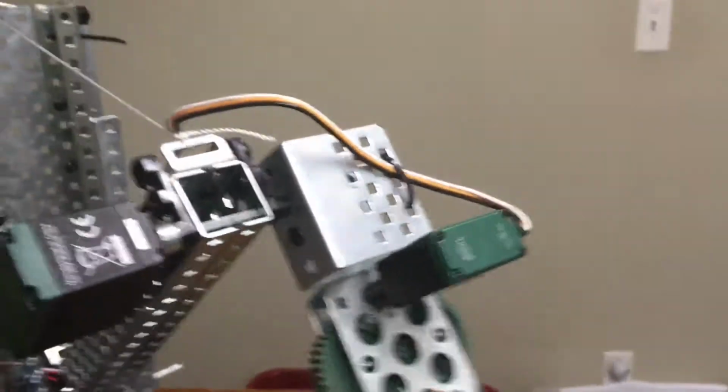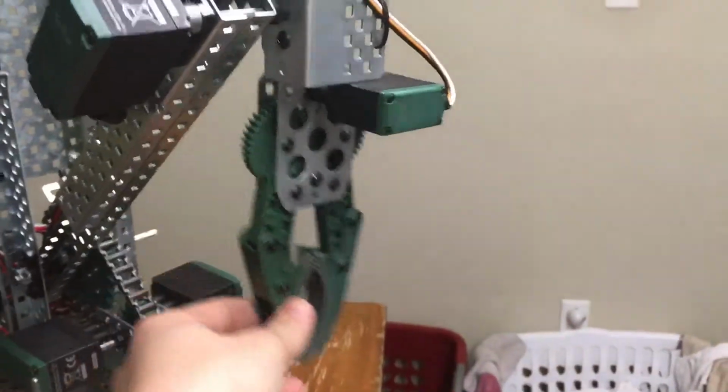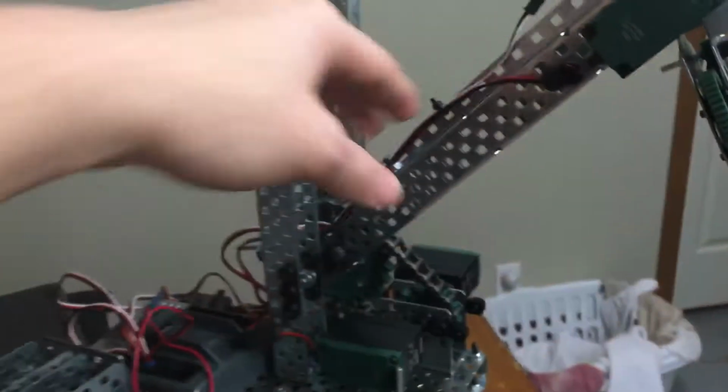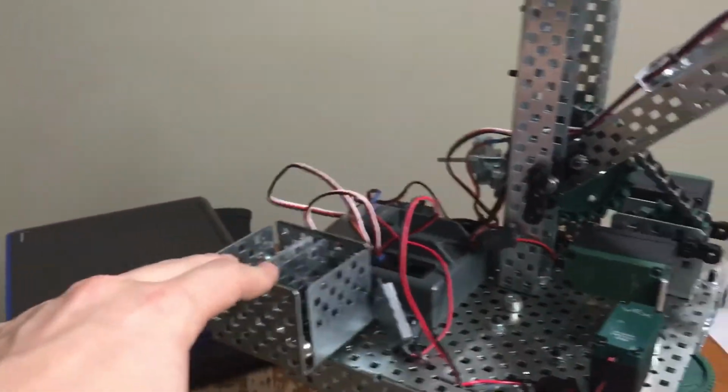And the claw mechanism is turned by another 393 so that it has at least 180 degrees of rotation here. And we have a claw mechanism here too, which is, as explained earlier, powered by a small gear with a servo, so it opens to a certain degree, but then never comes back. And also with the base, there was a lot of weight on this one side from the center point, so we decided to put some ballast on this side to make it more balanced.